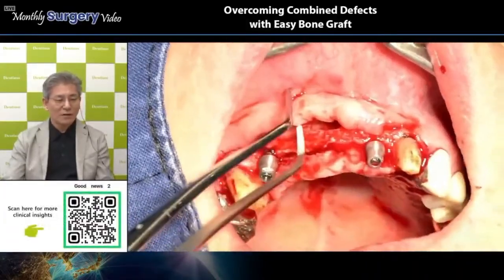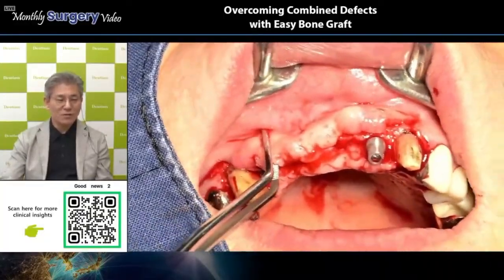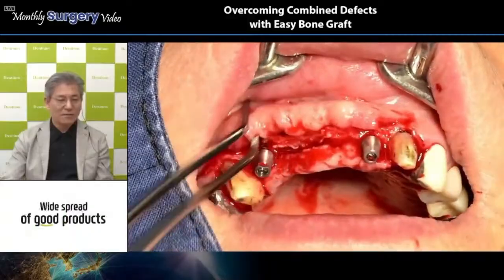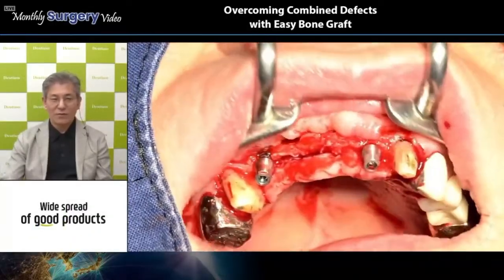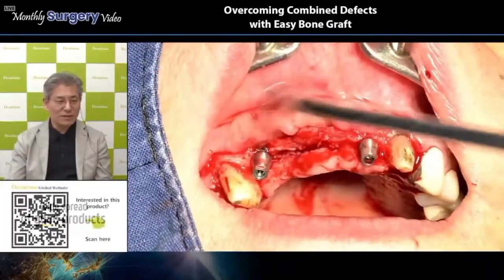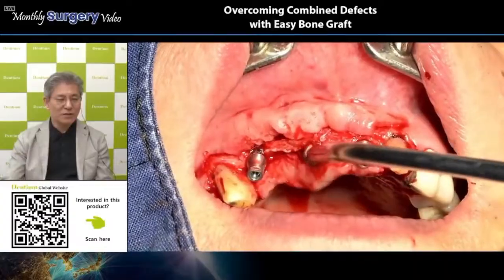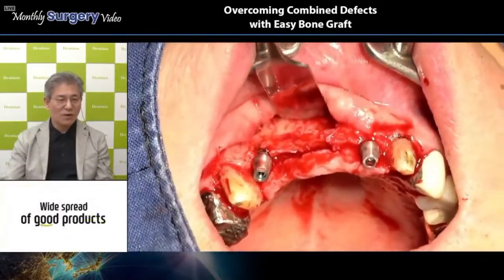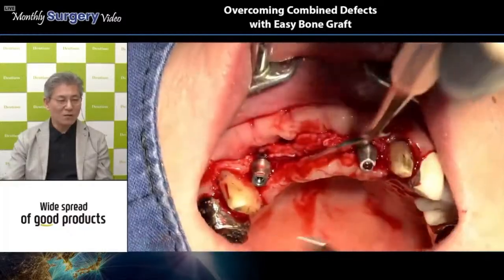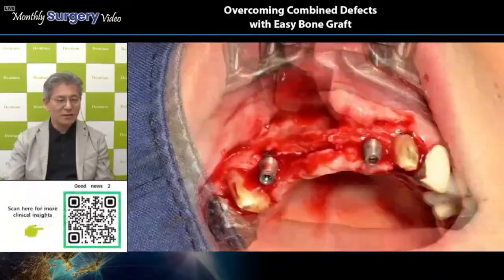Okay, all procedures were done. The essential procedure was done already, very fast and simple, from the osteotomy procedure to the insertion procedure of the fixture. So all the procedures were done in a simpler way. Now, checking the path and clearance.